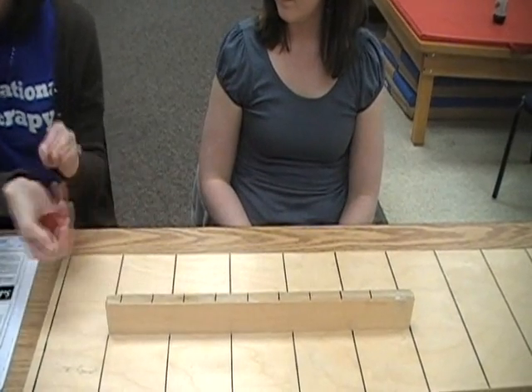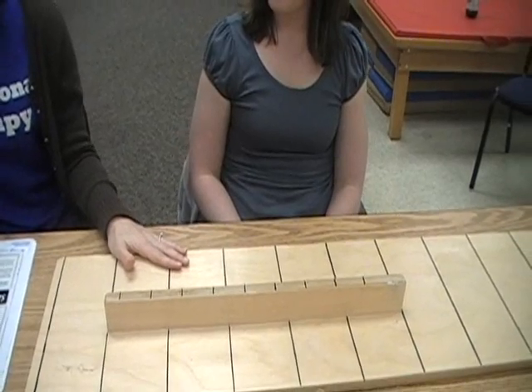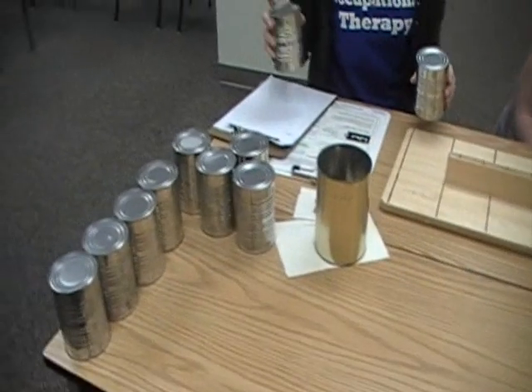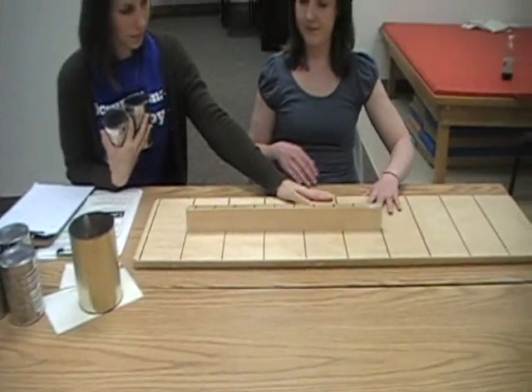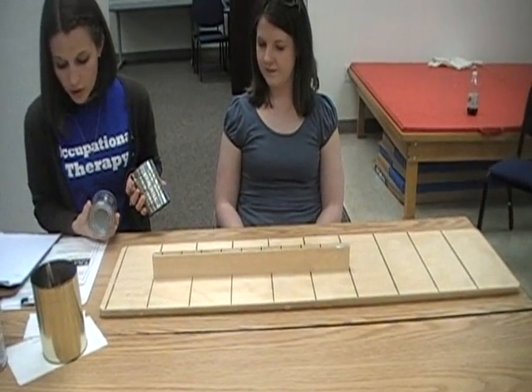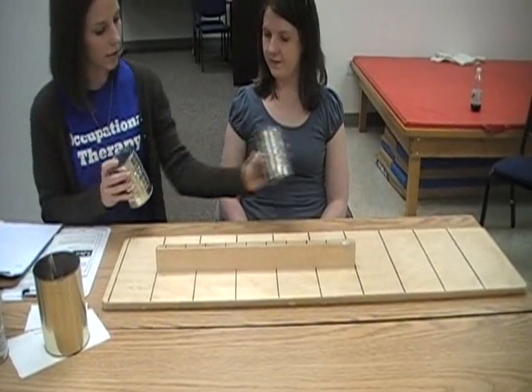The next task is called lifting large light objects. You have your board positioned 5 inches from the front edge of the table. You will place 5 empty cans in front of the board, 2 inches apart, with the open end of the can facing down — though these don't have an open end.